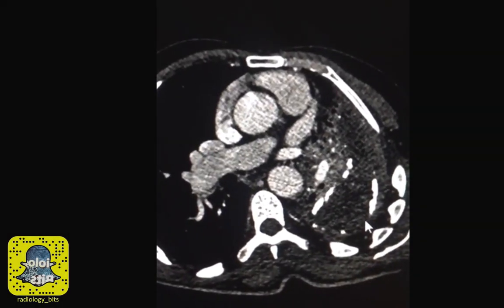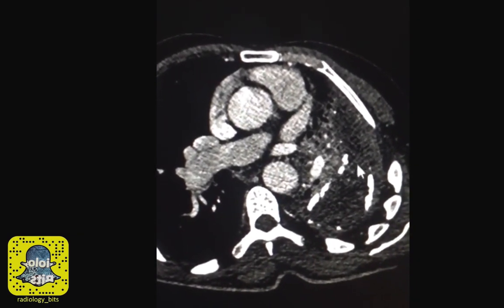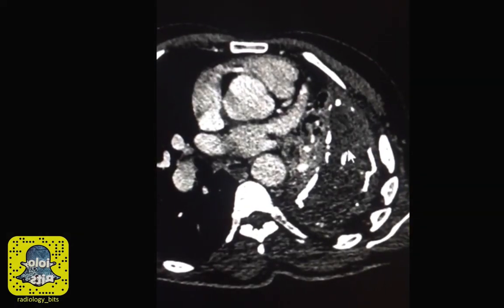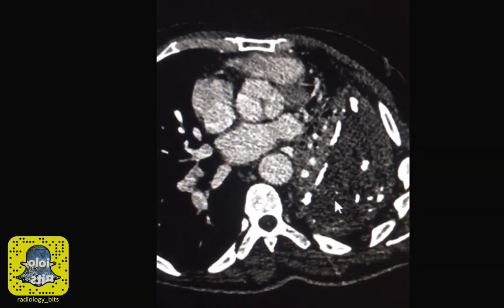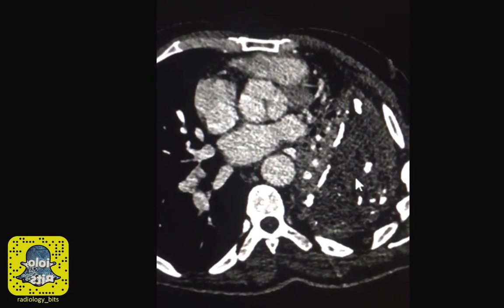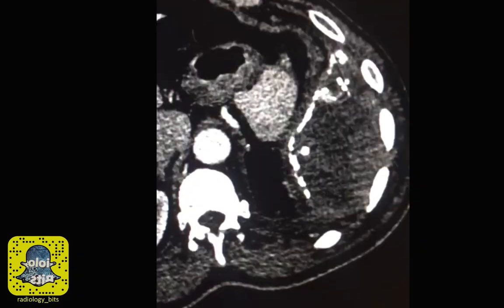We learned a few things today. First of all, tuberculosis is a known cause of calcific fibrothorax. We also learned that there are a few causes for the presence of air within a fluid collection. If it's not iatrogenic, traumatic, or related to infection, make sure there is no bronchopleural fistula.